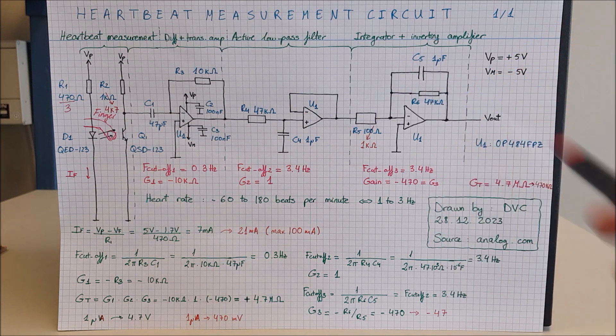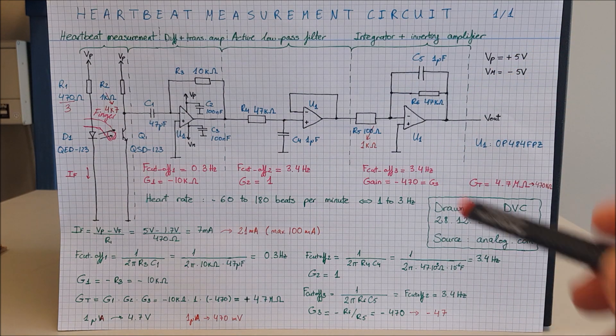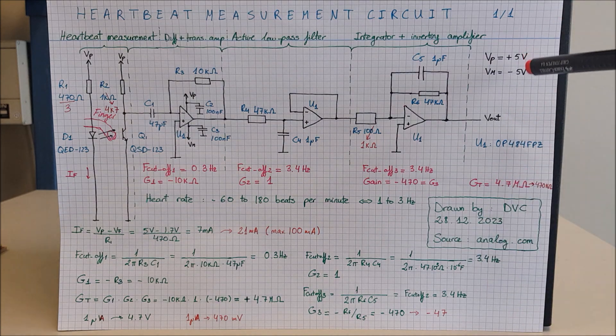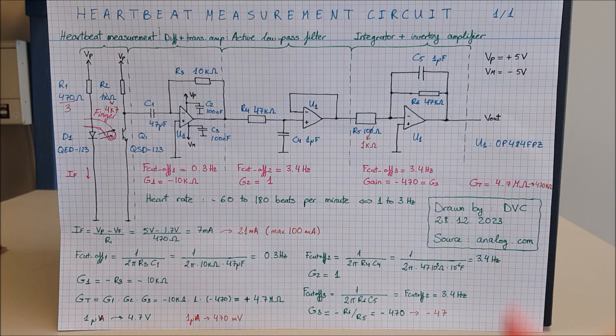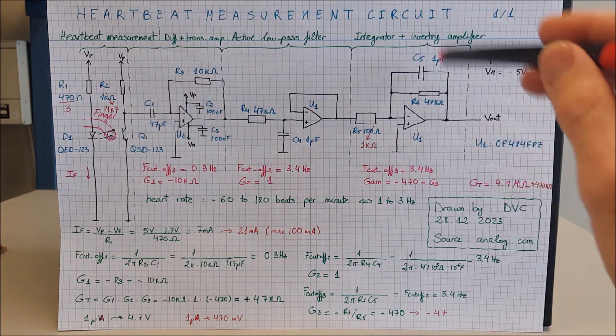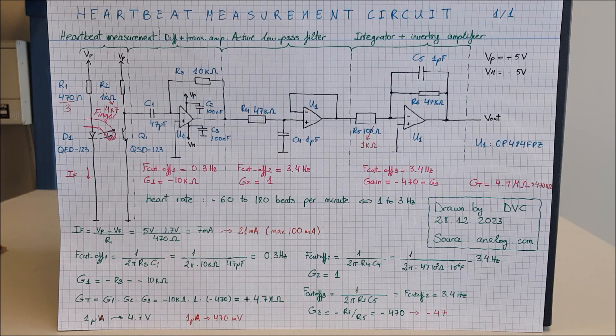Finally, I have lowered the gain because it was saturating, the signals were clipping. The signals cannot swing beyond the voltage rails, so R5, I made it 1 kilo ohm, so I decreased the gain by 10 of the last stage. As a result, the total gain is 470 kilo ohms, meaning that a 1 microampere current will produce 470 millivolt signal. Now let's go take a look at the implementation.